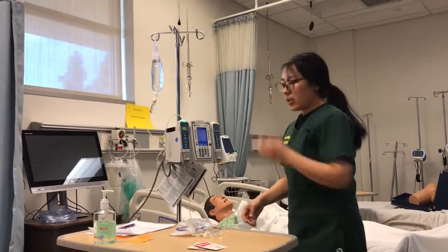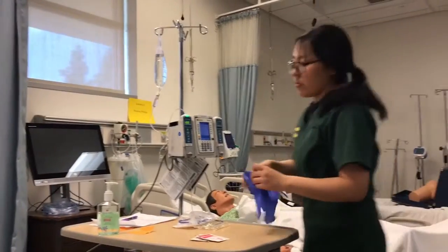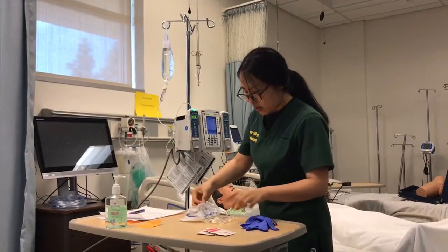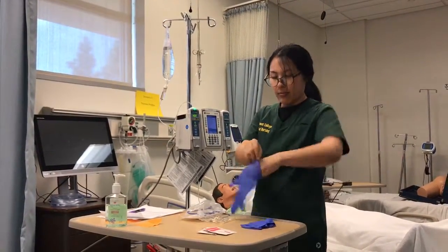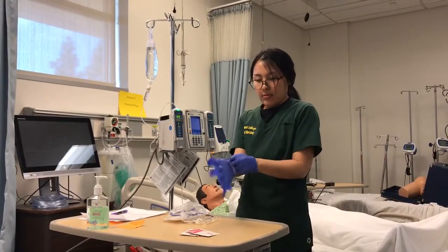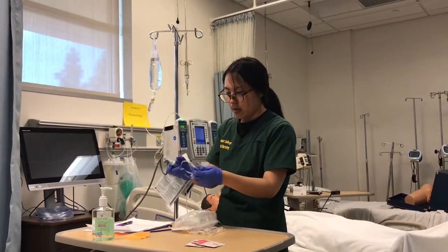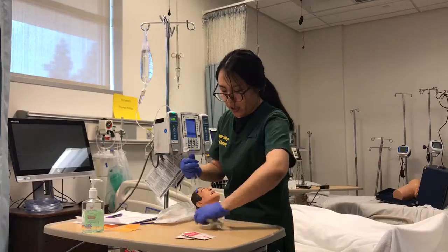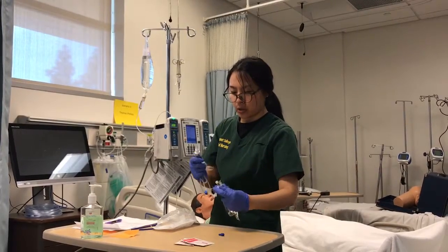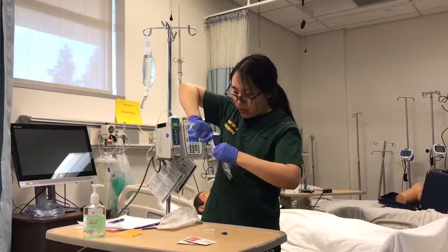After all that, let me go grab new gloves here. Then I'll do hand hygiene again. Okay, so wear the gloves. Touching the top. Also, go ahead and pick up the bag.